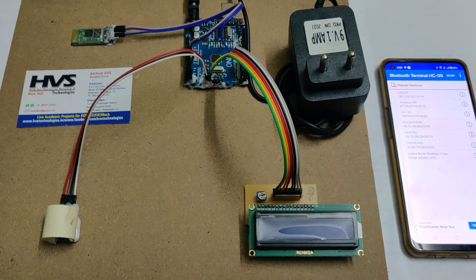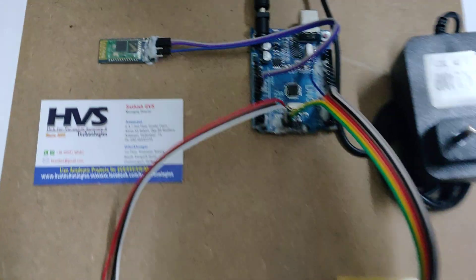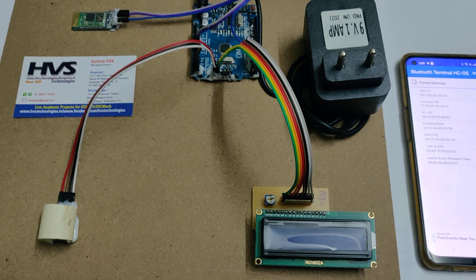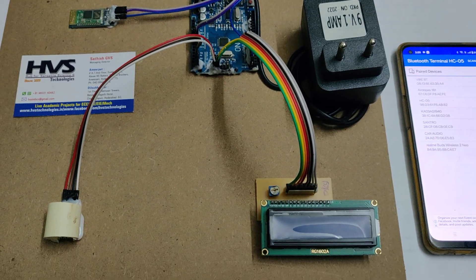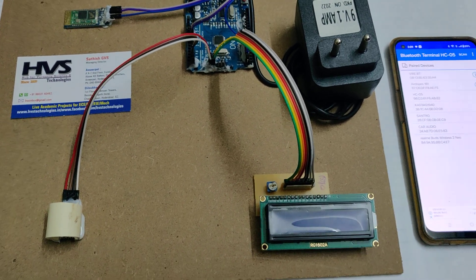Welcome to the project demonstration of a non-invasive glucometer using Arduino. Here we are going to monitor the glucose levels from a person without taking blood samples. In real time we take the blood samples and calculate the glucose levels, but now we are using a non-invasive sensor which is a customized one.